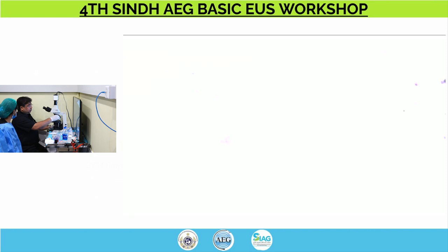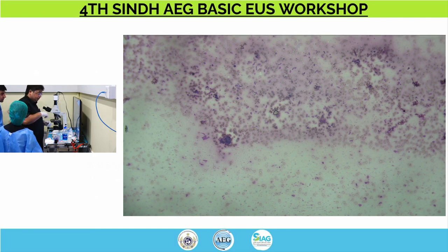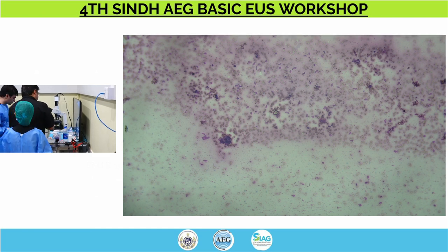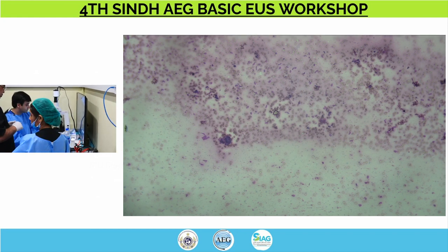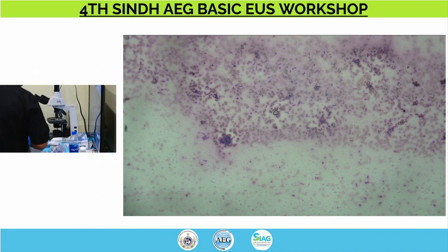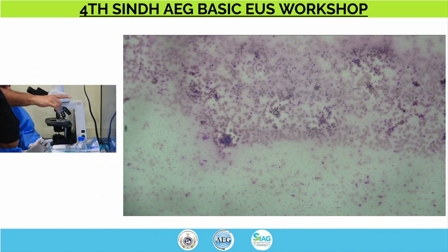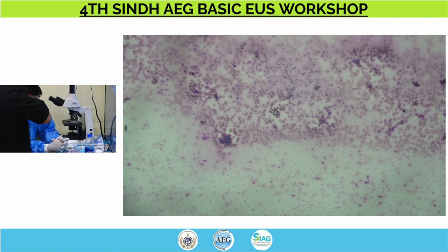Let me just see them. Come. That's perfect. Is there anything to point out? Is there any pointer that I can use? Nuclear shape, right, right, that's the key.